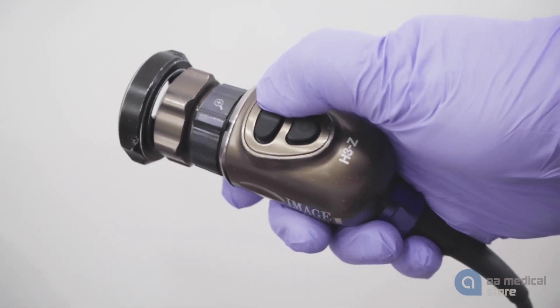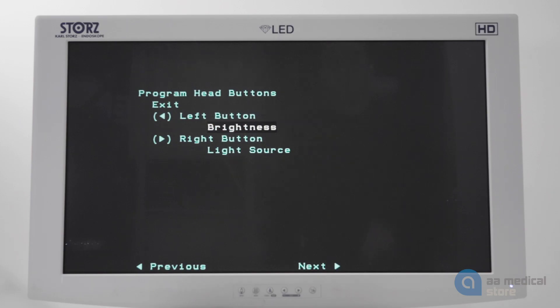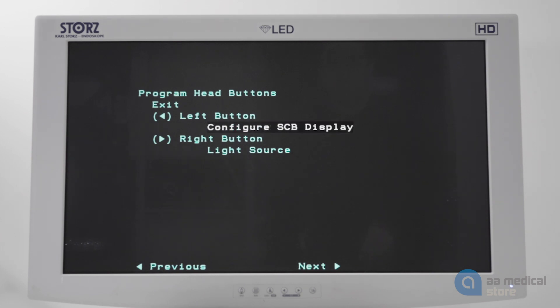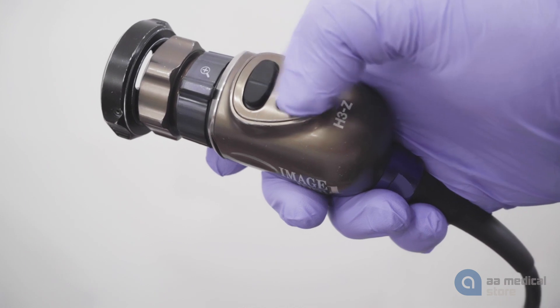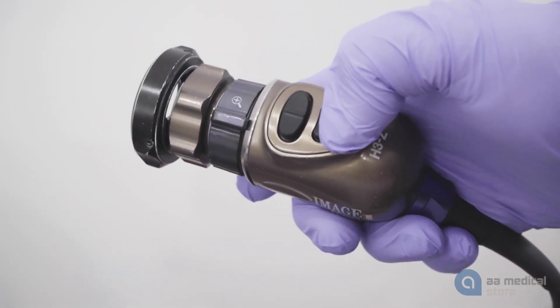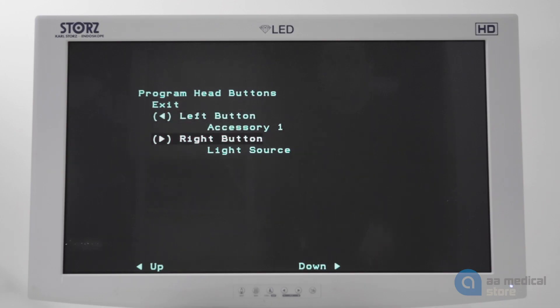Press the left or right button to scroll through the options to find the function you would like the left button to perform. Press the center button to make your selection and repeat the same process to program the right button.